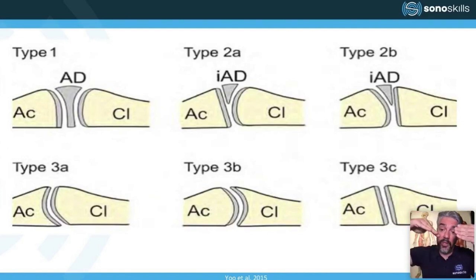You can even see the distal capsule of the AC joint within the subacromial space, and sometimes even some fibers of the supraspinatus when the patient abducts his or her arm. We also know that the disc might be present, and it's very prone to degeneration, and I believe around the fourth decade, in many cases this disc is absent or degenerated.